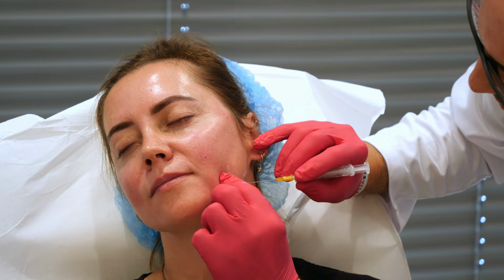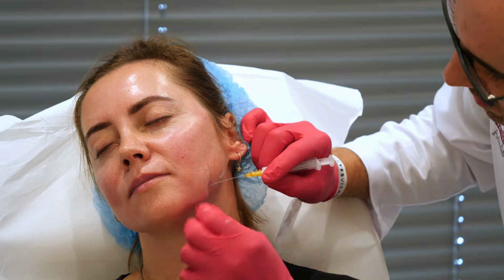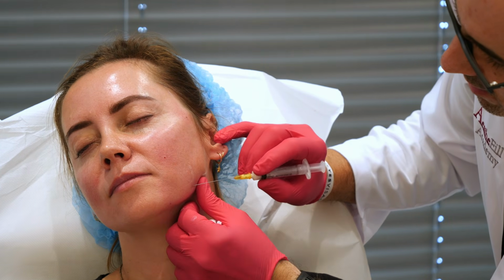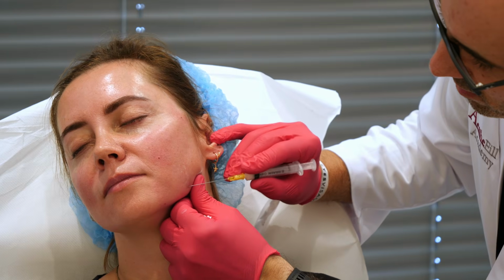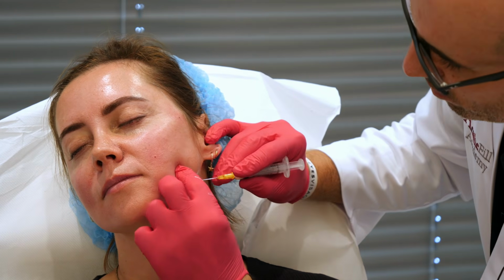If you feel that the cannula does not pass, you can make a rotation to attain the good plane.